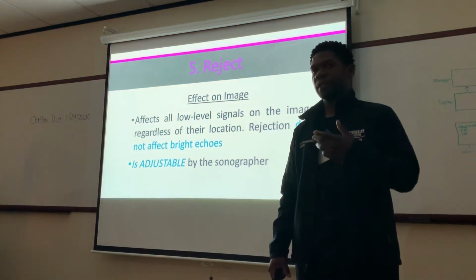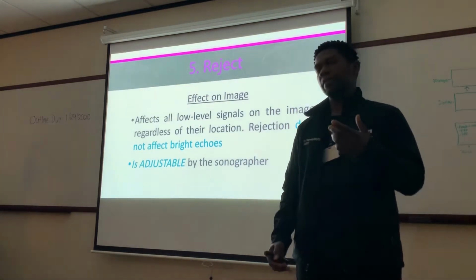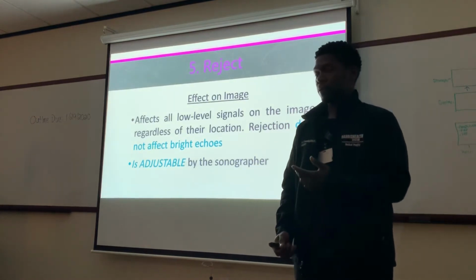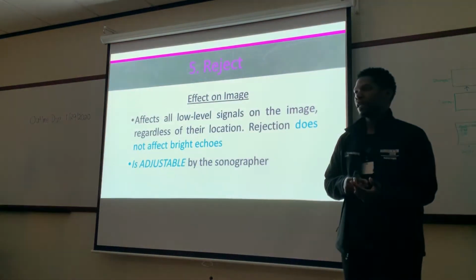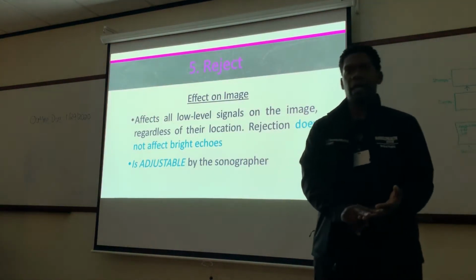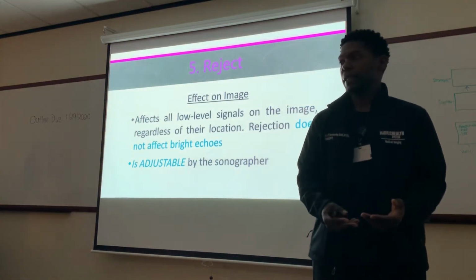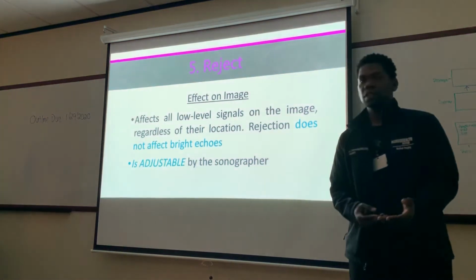It's not your scanning ability as a technologist that makes you better. It's your ability to manipulate your machine and get the best images possible, for image optimization. Because it's really not about us. It's not about our skill. It's not about technique. I'm going to steal Dr. Black's line: it's about the patient you're serving, right? So you want to give that patient your best. In order to give them your best, you have to know how to manipulate your machine to the best it can be.